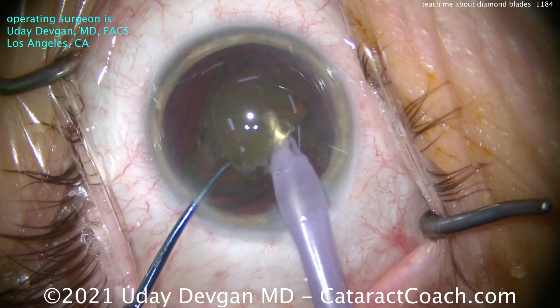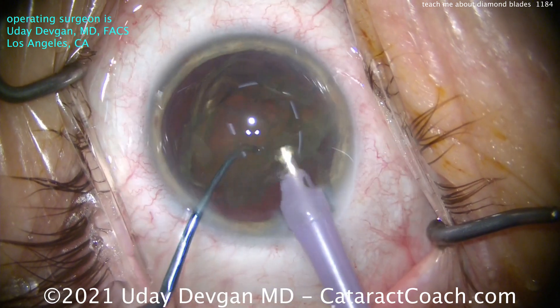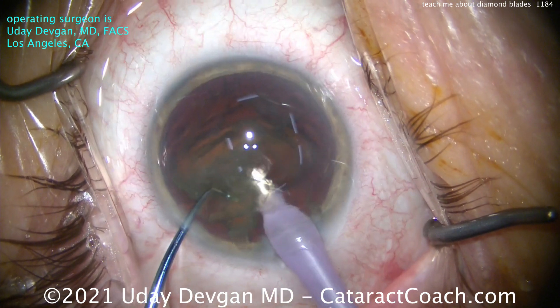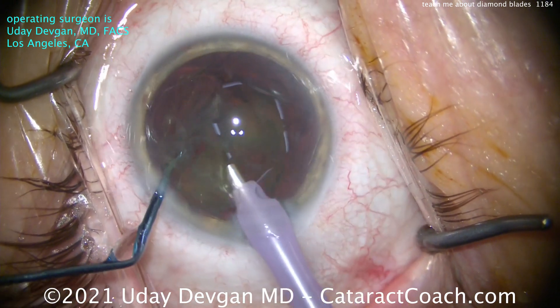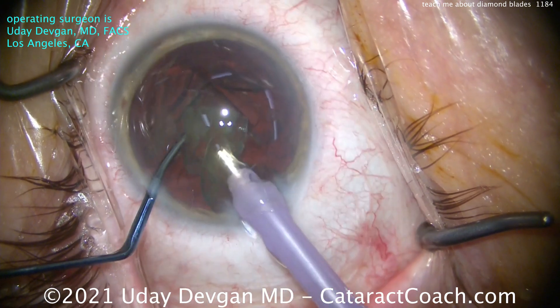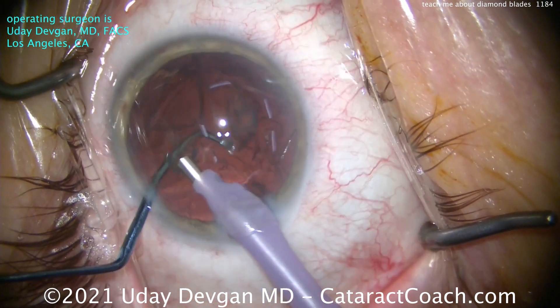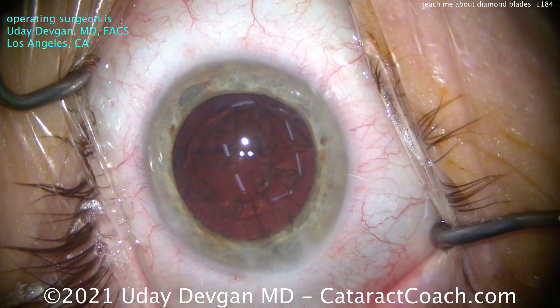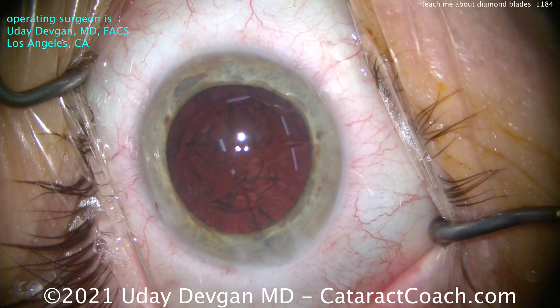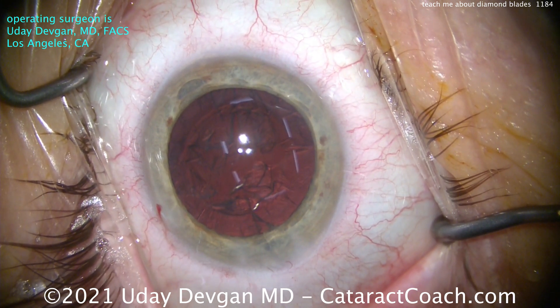For my own eyes, make the incision with a diamond. The reason is that diamond is ultra hard — it's the hardest thing on the Mohs scale of hardness, a 10 out of 10, and nothing else is even close. So you can make a diamond keratome really sharp; the edges can be infinitely thin, and that allows us to make a very precise incision.